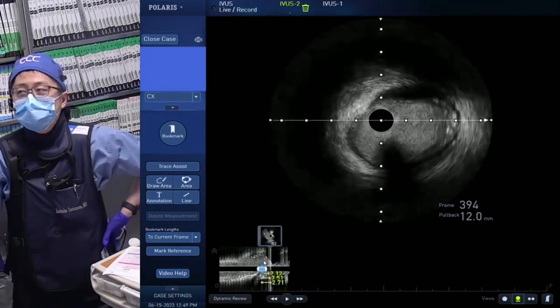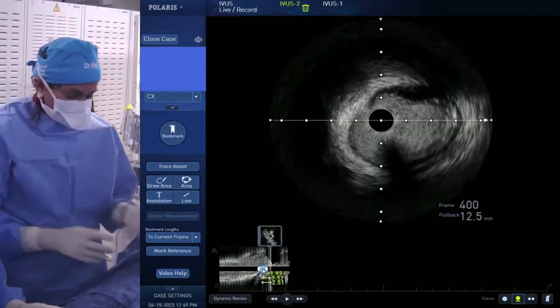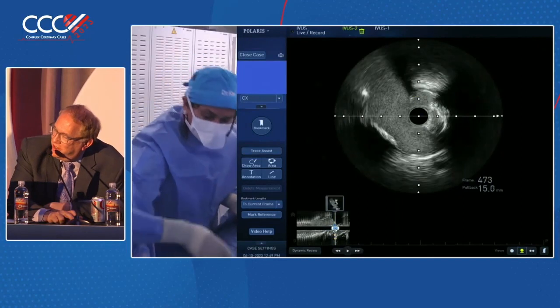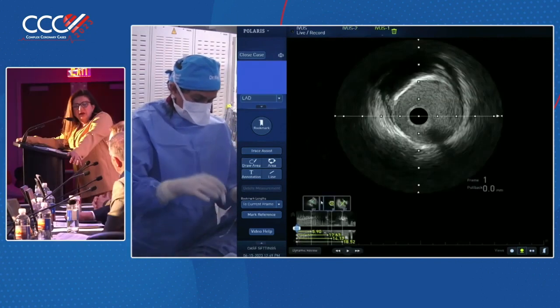So after the imaging, what would be the plan? Yeah, I agree. The osteocirc looks fine, so I'd put one stent into the left main, into the LAD, with 3 wires just to protect everything, and provisional. I think that's what Antonio wants, correct?